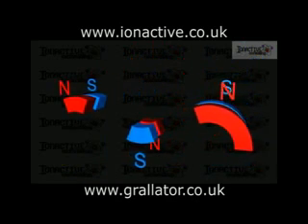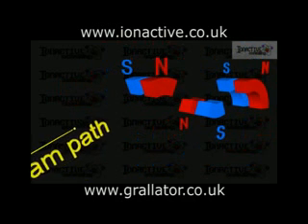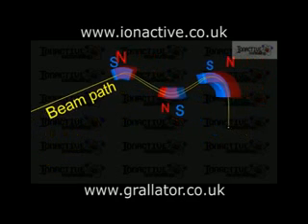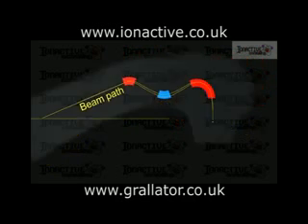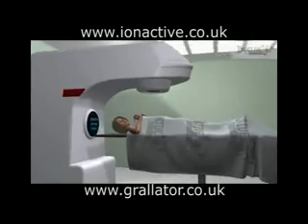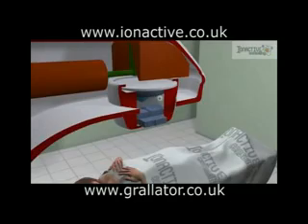An alternative is the 112.5 degrees or slalom magnet. This design is also achromatic, but has other advantages, such as producing a beam that is focused in two directions and also reduces the overall height of the machine. For this magnet to be used, the beam, and hence gantry, must be angled upwards at 22.5 degrees. Once deflected, the beam enters the treatment head for modification prior to final use.